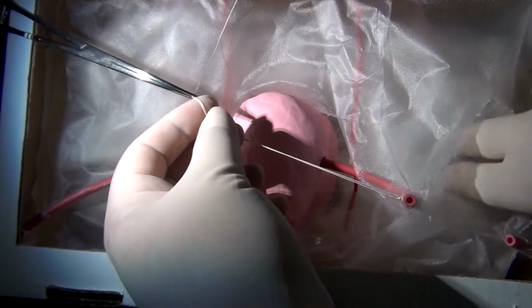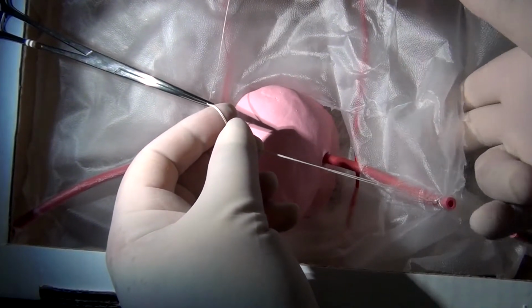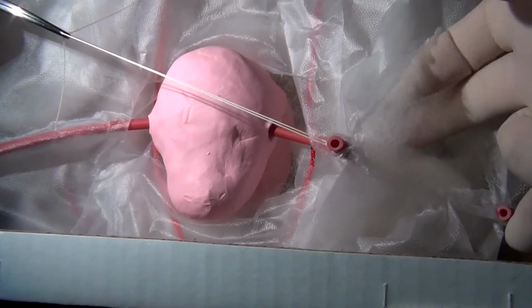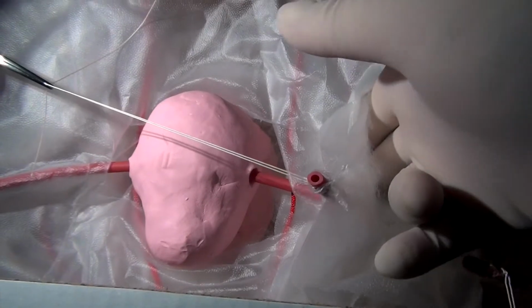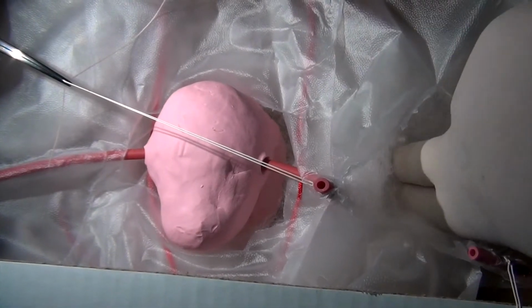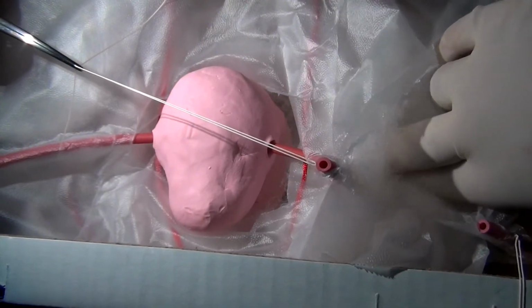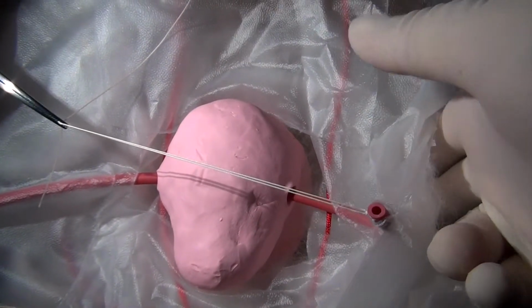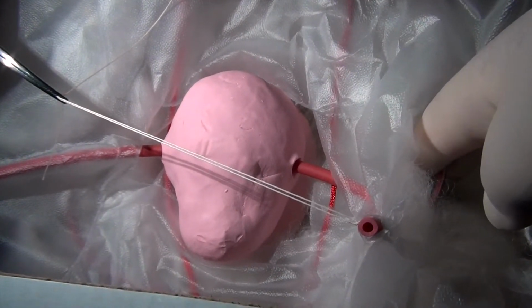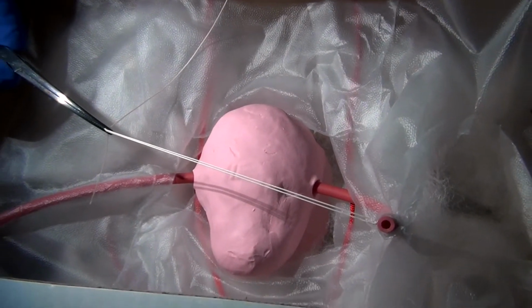So as I spread to separate, I'm now on the medial aspect of the sheath of the posterior broad ligament. So I'm feeling here now, and my ureter is going to be a Foley catheter, which should be distal to my infundibulopelvic ligament. In the human body, we can take our finger and pull down in this area to feel the snapping of the ureter, which feels like an accordion. However, for the sake of this dissection, we're going to identify it.